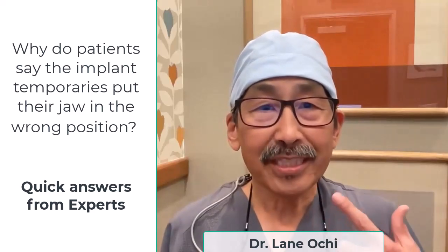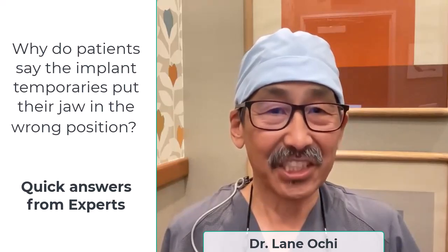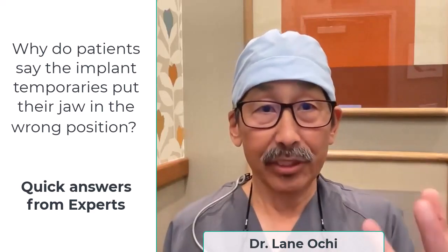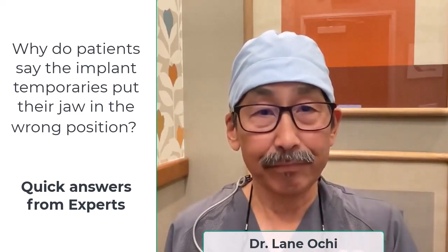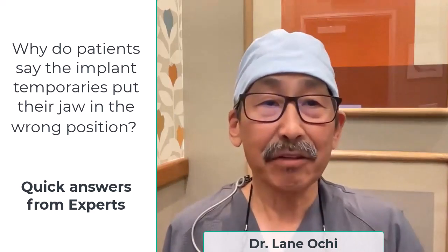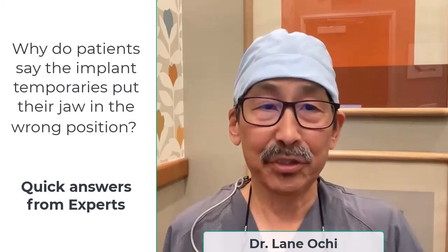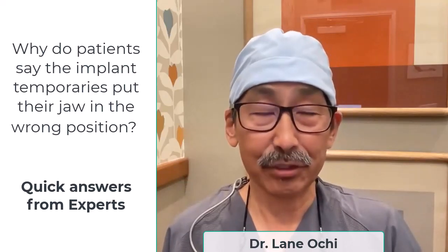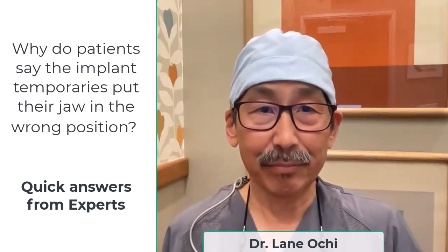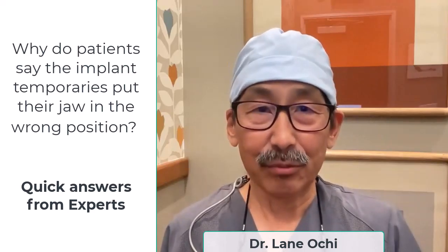So most AP slides occur on the posterior as patients have to move from CR, CO first contact, into MIP. Now, this causes the lateral pterygoid to contract and bring the jaw forward. By using a QuickSplint and eliminating those posterior interferences, now the lateral pterygoid can relax and go back to its most comfortable optimal position, and this allows us to establish the occlusion. Once we establish the occlusion, then we can make our patients comfortable in their implant provisionals, and then as we transition them to definitive restorations, everything works out really well and everyone's happy.